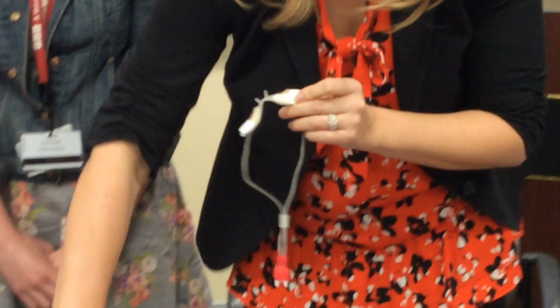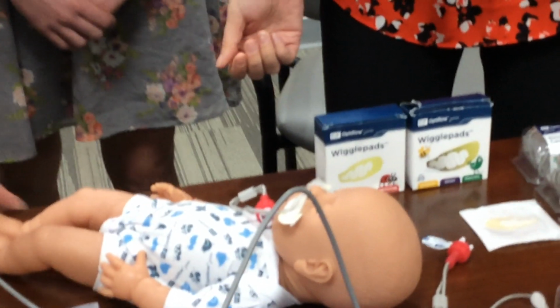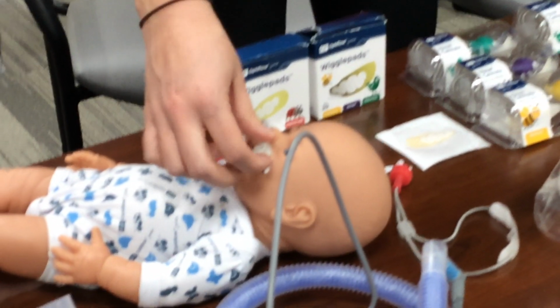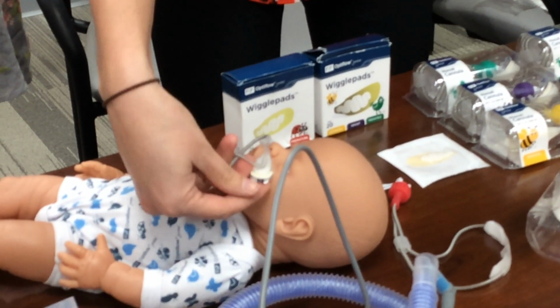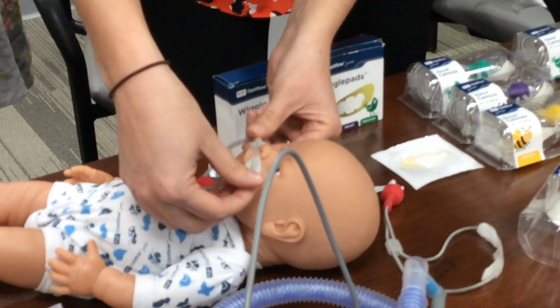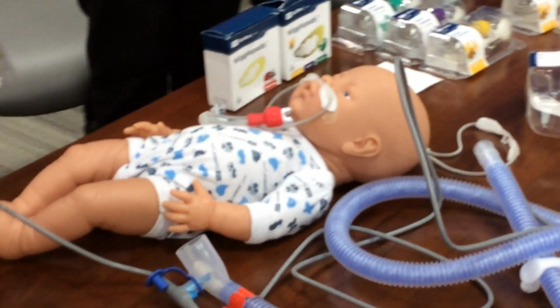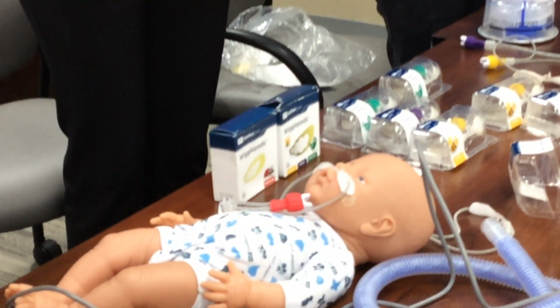Then you place it in the nares and stick it down right away. The little bed portion is still underneath, and you can just peel that out. But realistically, I would never do this without a respiratory therapist, because they have to start it. Good to know, but just saying.